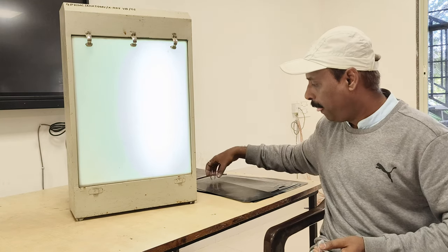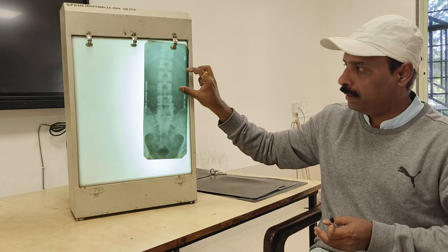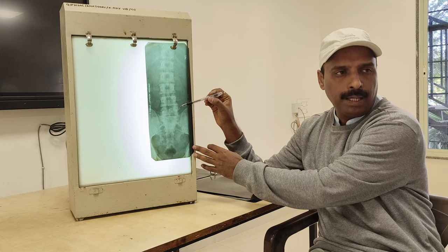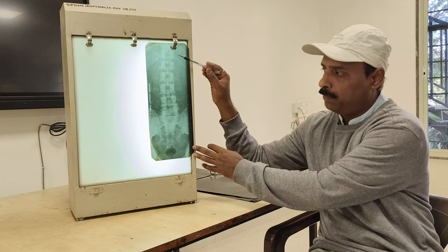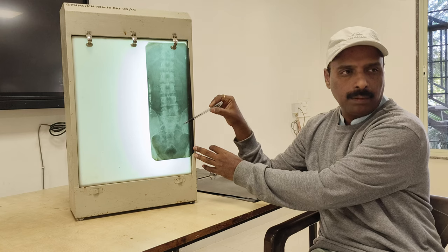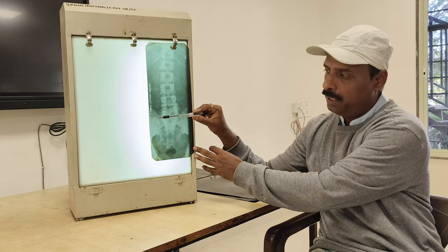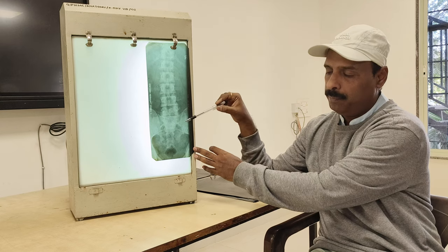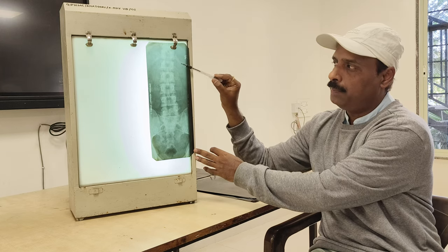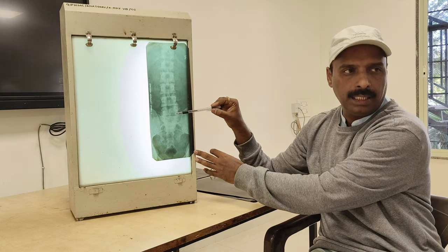Next we have to deal with how we take the spine, lumbar spine x-rays. In this you have to remember almost all the lumbar vertebrae. This is the x-ray of lumbar vertebrae, AP view. When we take this, you can see a little part of the sacrum and the ilium of the hip bone is covered. In the inferior you can see the iliac bone, ilium, then we have the sacrum posteriorly, and these are the lumbar vertebrae. Here you can see the rib cage, the 11th and 12th ribs, and these are the lumbar vertebrae.